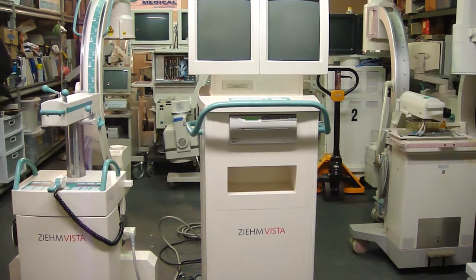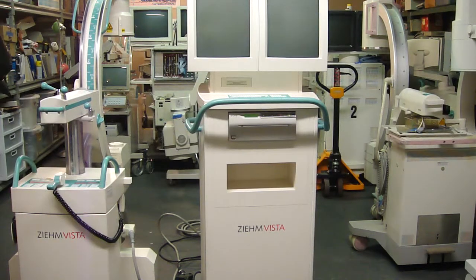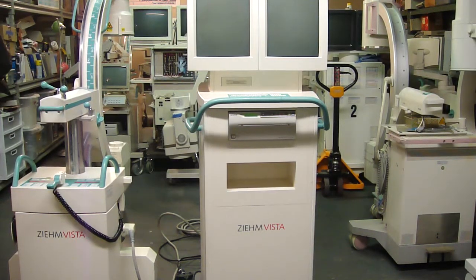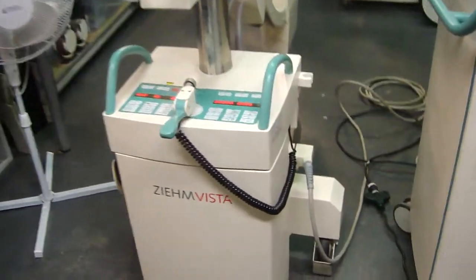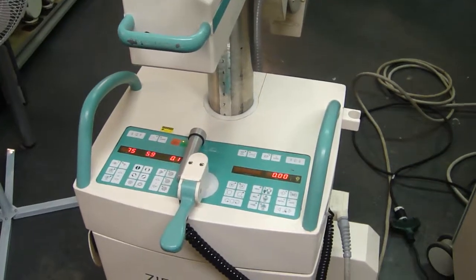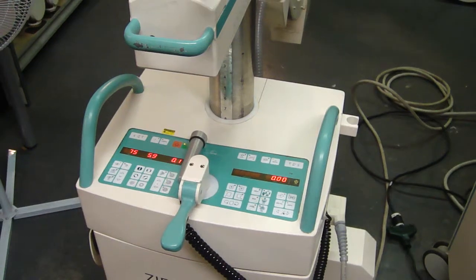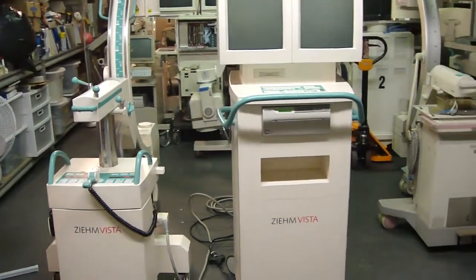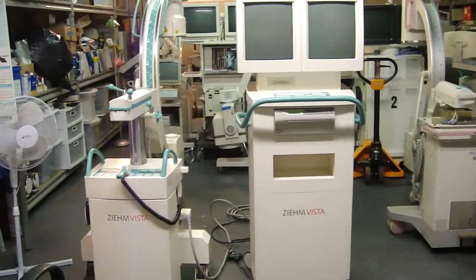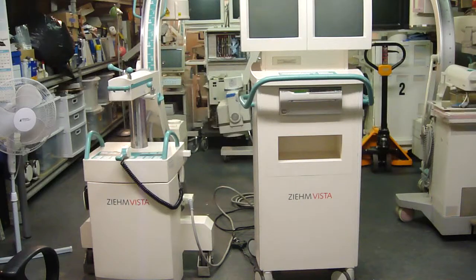The Ziehm machines usually take a little bit longer to boot up, as opposed to an OEC which is much, much faster. But we'll take a look — there we go, the machine boots up and it's turned through some more checks.